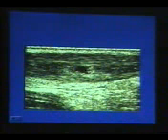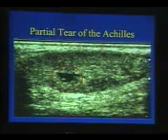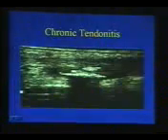And here is the tendo Achilles, and you can see a small tear which is within the substance. It is an intra-substance tear involving a quarter of the tendon. This is a partial tear again. You see the discontinuity. You will measure the whole tendon, measure this area, and get the percentage.